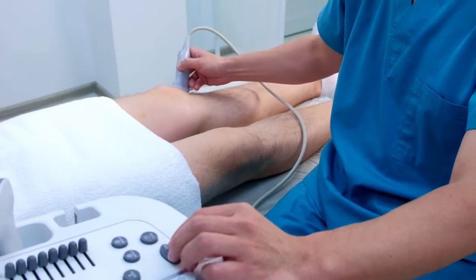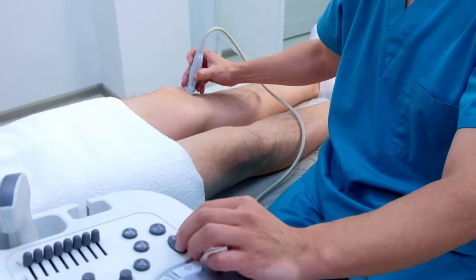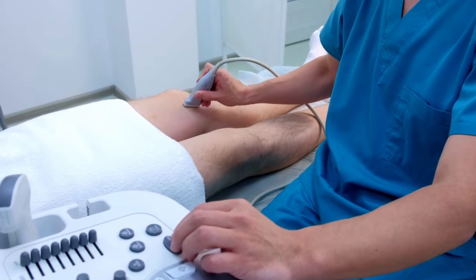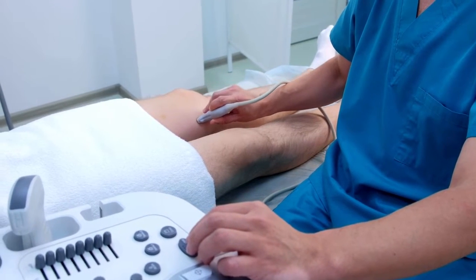So if you are experiencing leg pain, it's very important to ask your doctor to follow up with a leg artery ultrasound. This is when we put some gel on the surface of your legs and use a probe to take a look inside the arteries. The sound waves from the probe are used to produce an image inside your arteries, like taking pictures, and this will give us a more accurate picture as to where your arteries are narrowed or may be blocked.